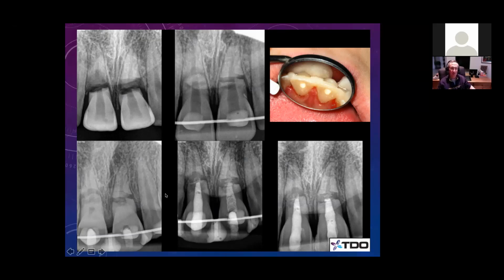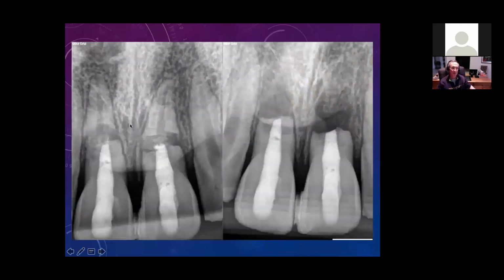canal treatment. Same thing, this tooth, you can kind of see here, had multiple fracture lines, and the sinus tract didn't heal after a month of calcium hydroxide. So we obturated these and then flapped them. And I probably wouldn't have needed to take out this apical segment of this one. This was the one with the problem.